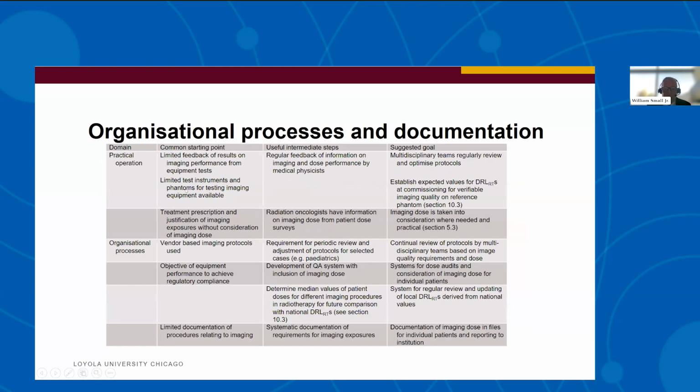I do think many of us still sit in the common starting point, but really we want to have multidisciplinary teams regularly reviewing this, establish expected doses, document it. I think the majority of us don't document the IGRT dose that we give to patients, which can be significant.